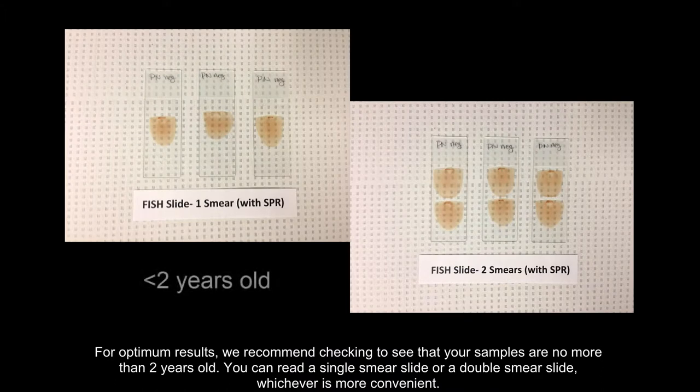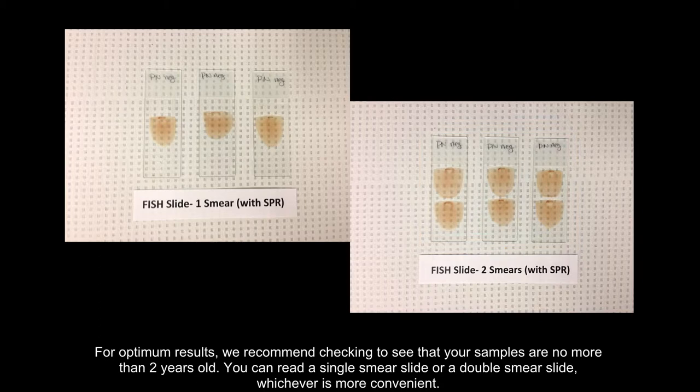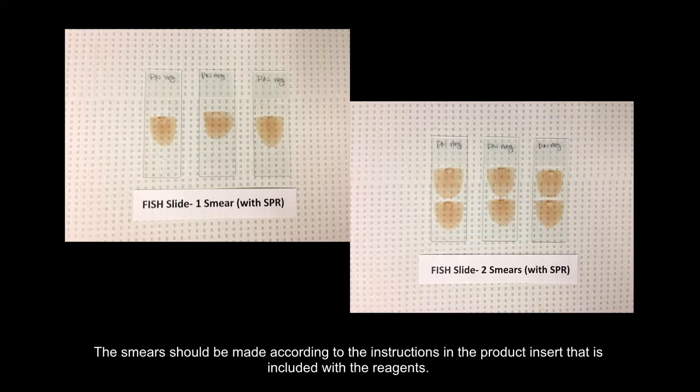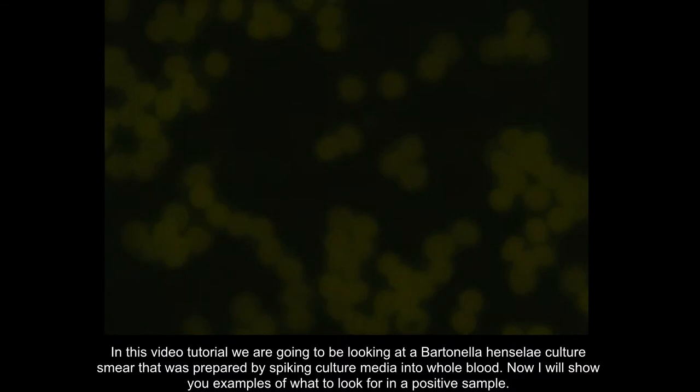For optimum results, we recommend checking to see that your samples are no more than two years old. You can read a single smear slide or a double smear slide, whichever is more convenient. The smear should be made according to the instructions in the product insert included with the reagents. In this video tutorial we are going to be looking at a Bartonella henselae culture smear that was prepared by spiking culture media into whole blood.